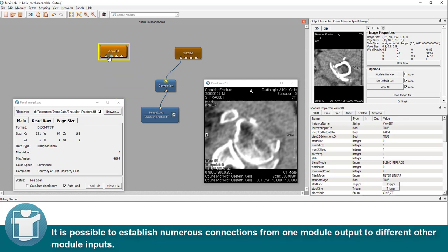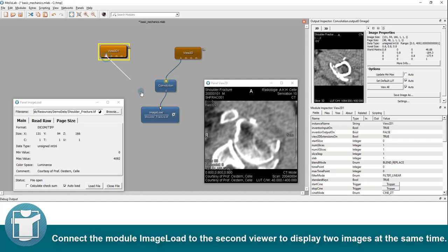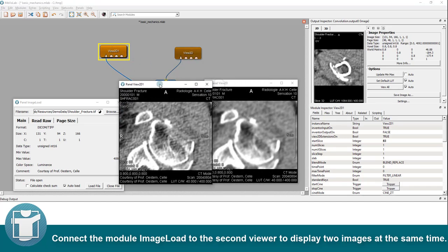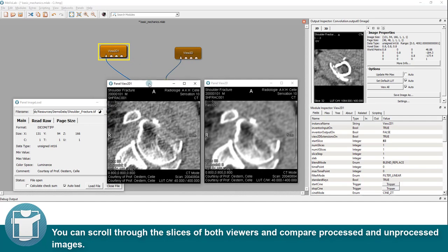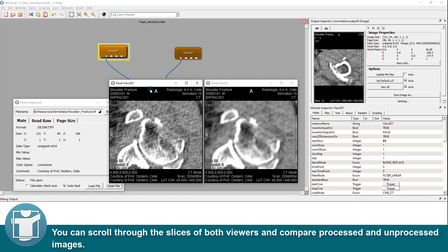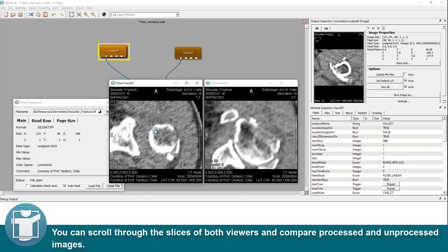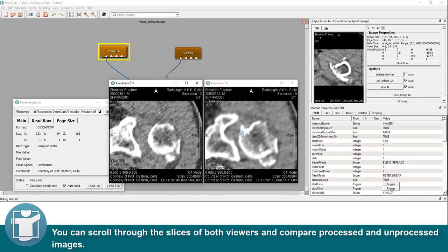It is possible to establish numerous connections from one module output to different other module inputs. Connect the module image load to the second viewer to display two images at the same time. You can scroll through the slices of both viewers and compare processed and unprocessed images.